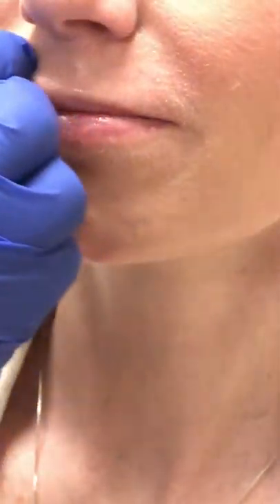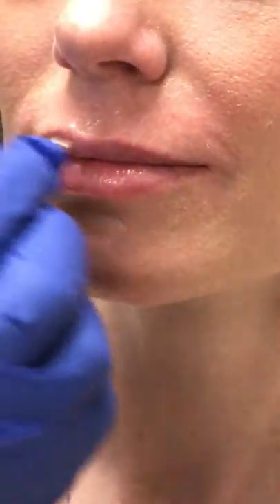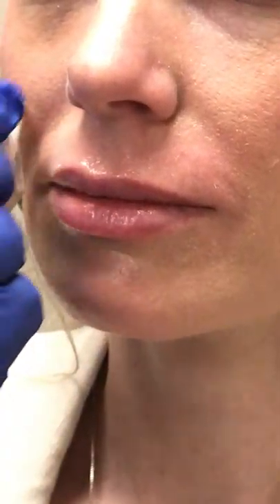First thing I'm going to do is use an alcohol pad and clean you off a little bit — it might be a little burny. Here's a tissue for you just in case you need it. I like to give patients a mirror so they can look as we're doing it. The lip tends to be very subjective, so some patients really want a lot of volume and some patients want a little less, so I like to tailor it to whatever each patient wants.